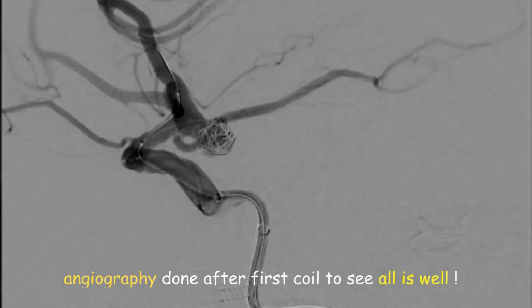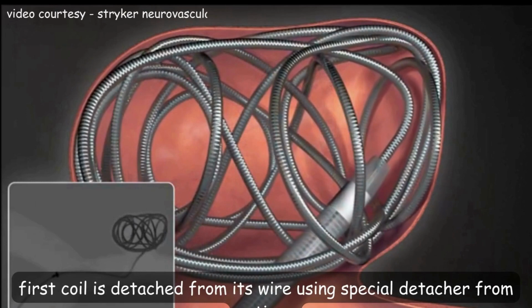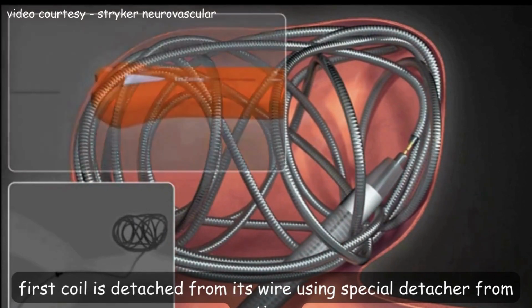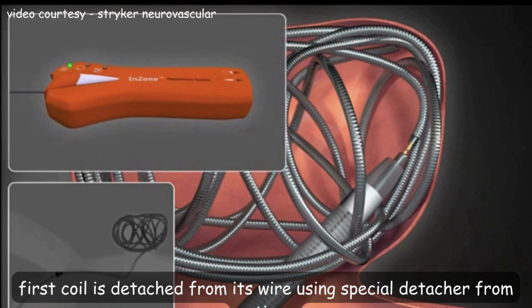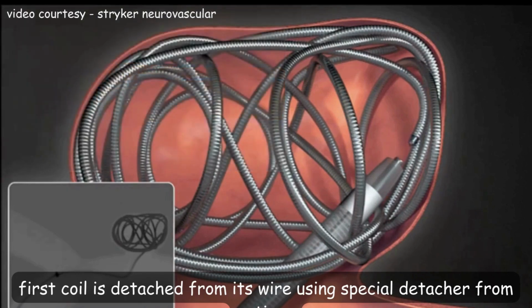Angiography is done after the first coil to see all is well, and once it's decided that everything is fine and the coil is inside the aneurysm, this coil can be detached from its wire. A special detacher is available. So this coil is detached from its wire electrolytically, and then the coil wire is taken out of that tube.